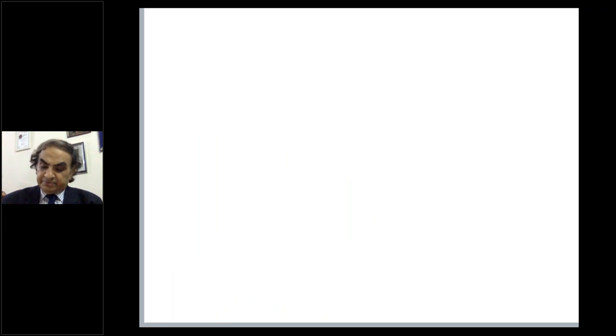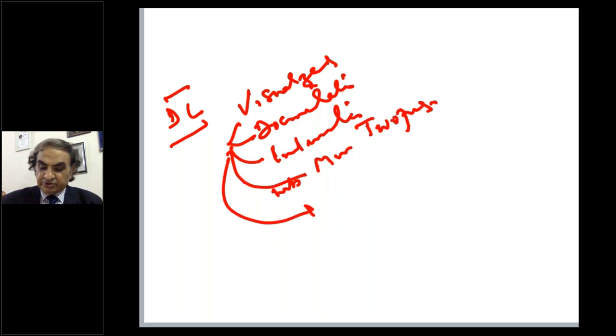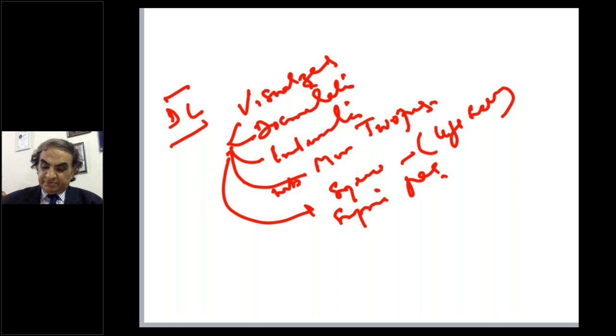With that, I think I'll conclude, because there is no end to it. But importantly, remember some salient features before I conclude. One, diagnostic laparoscopy is about visualization, documentation, and minimal intervention, with a minimum of two ports, both held in the hands of the surgeon who stands on the left side of the supine patient. The assistant is the mirror image.